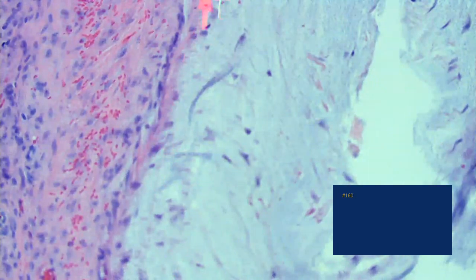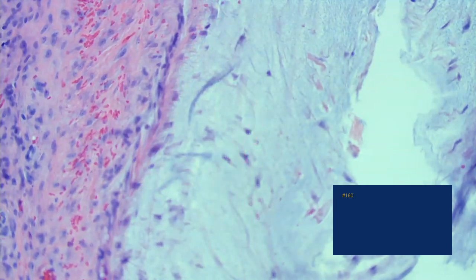This is called digital mucous cyst, but as you can see, it is not a cyst. It does not have a true epithelial lining like a cyst. These are some fibroblasts and some dermal collagen that's likely just compressed at the periphery of the mucin that's accumulated here.